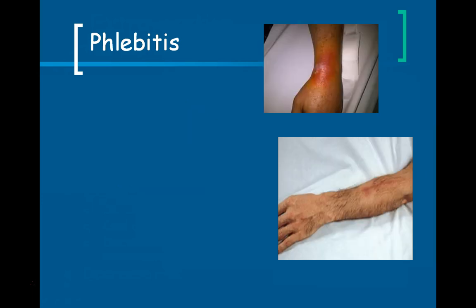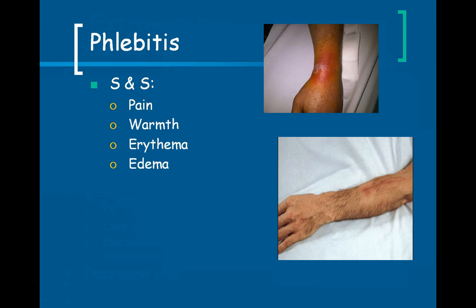And here's another couple of pictures of phlebitis. So signs and symptoms, often the first one is pain. So the patient puts on the call light and says that hurts. Or you go in and you start a solution or give an IV push medication and they say that hurts.